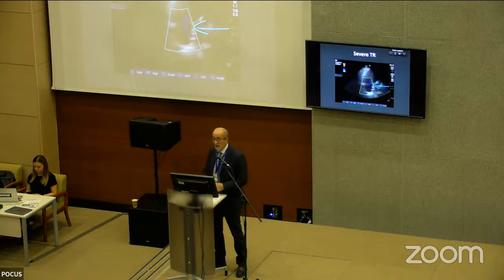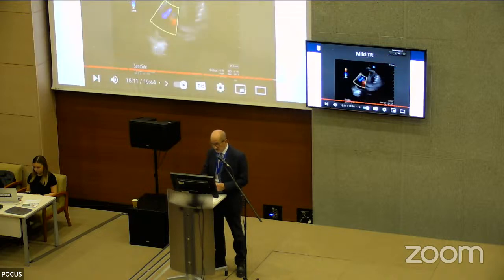Again, you can see the aliasing because of the velocity above the limit.